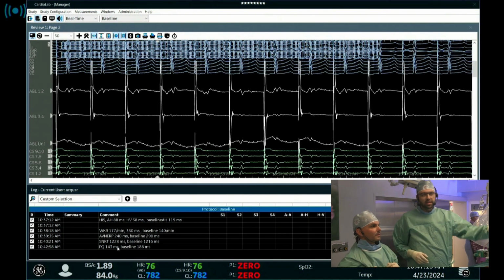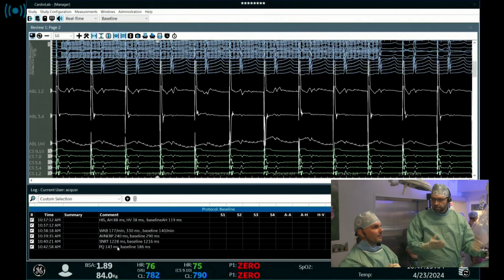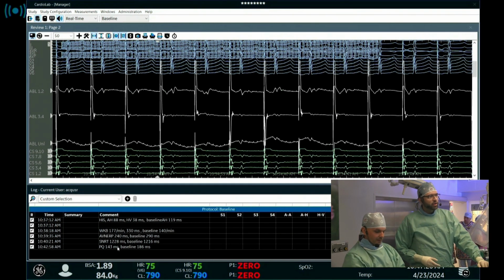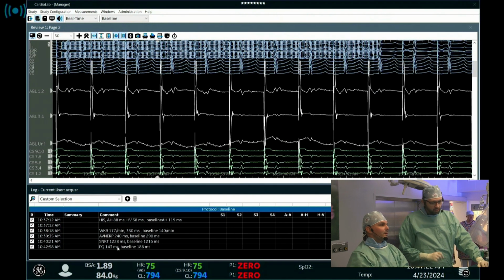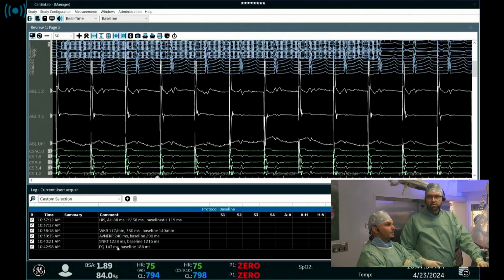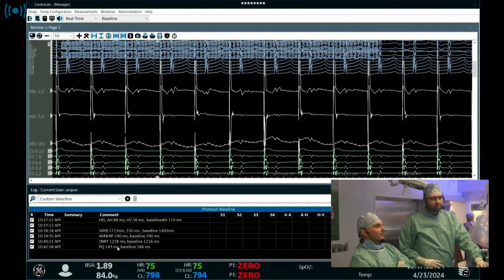Obviously, SNRT did not change because we didn't touch the sinus node. And if I may make only one comment, we discussed with Roman that this procedure is technically very simple and can be done in like 40 minutes. But there are many unknowns, so we need to study more. So we believe that this approach is correct for now.